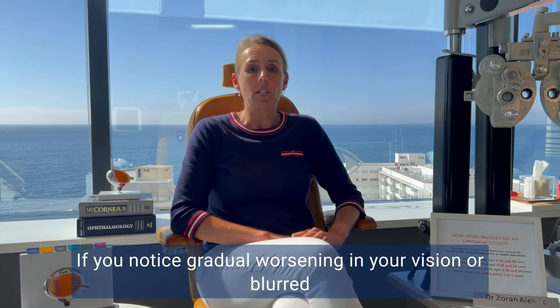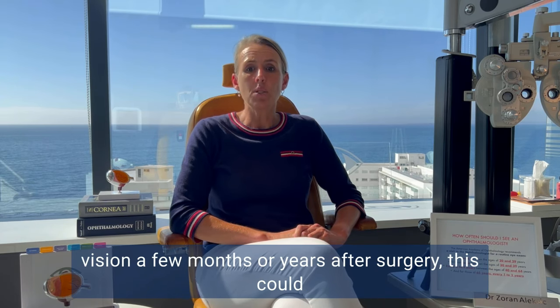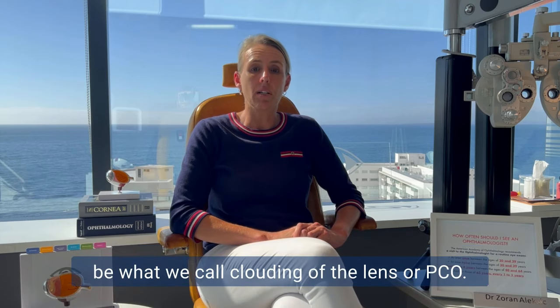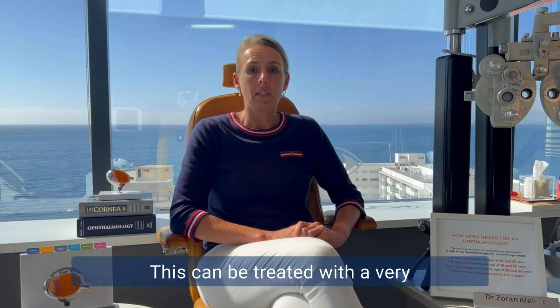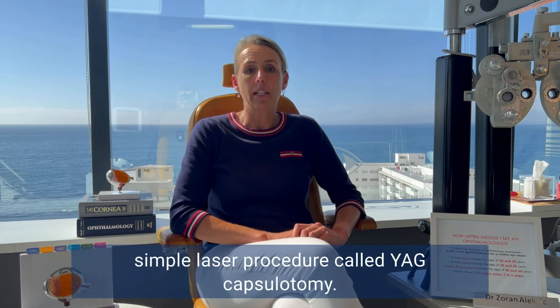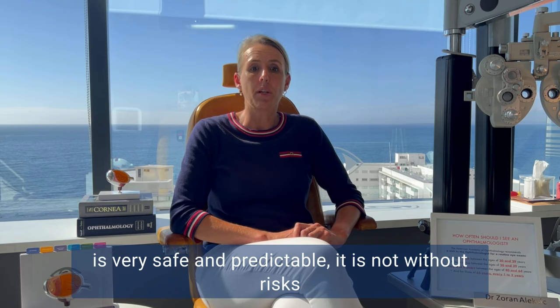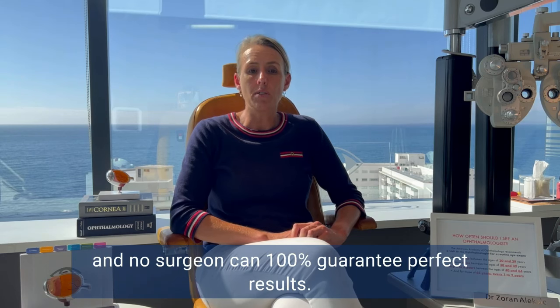If you notice gradual worsening in your vision or blurred vision a few months or years after surgery, this could be what we call clouding of the lens, or PCO. This can be treated with a very simple laser procedure called YAG capsulotomy. It is important to note, although cataract or lens surgery is very safe and predictable, it is not without risks and no surgeon can 100% guarantee perfect results.